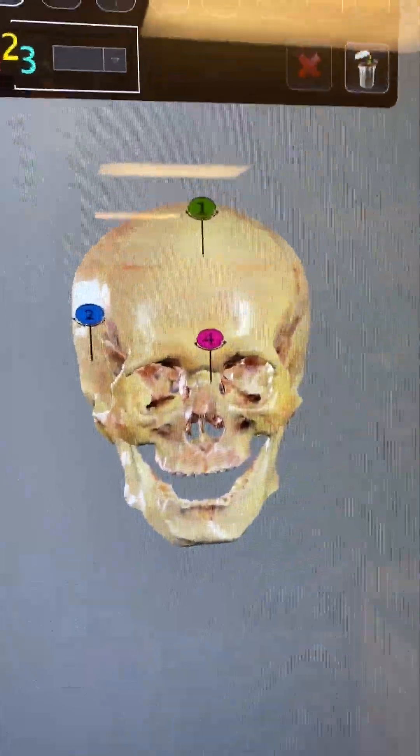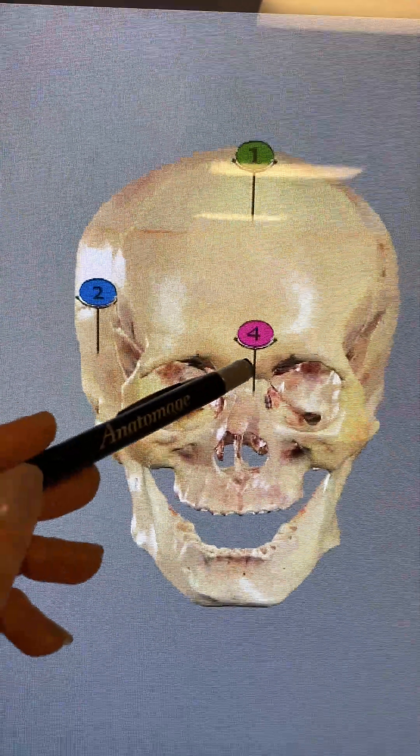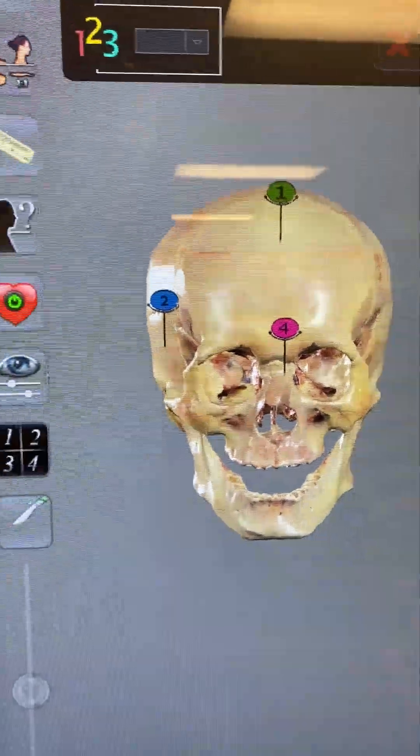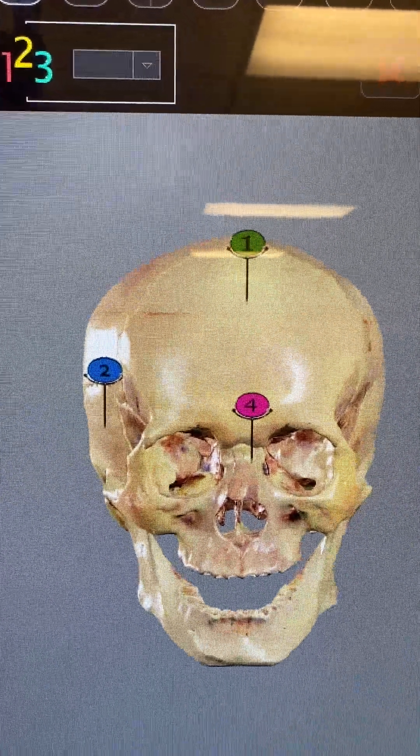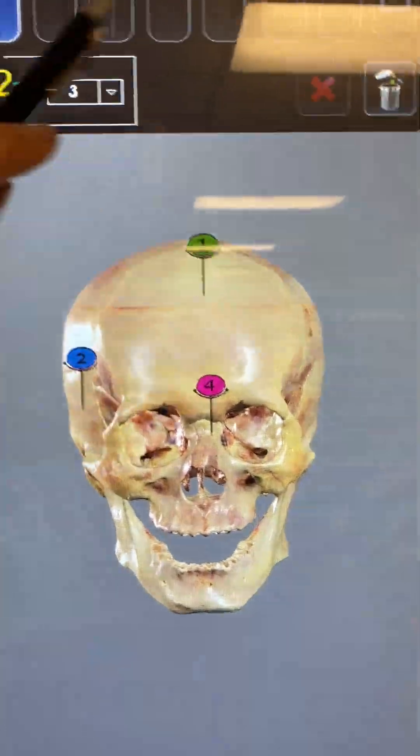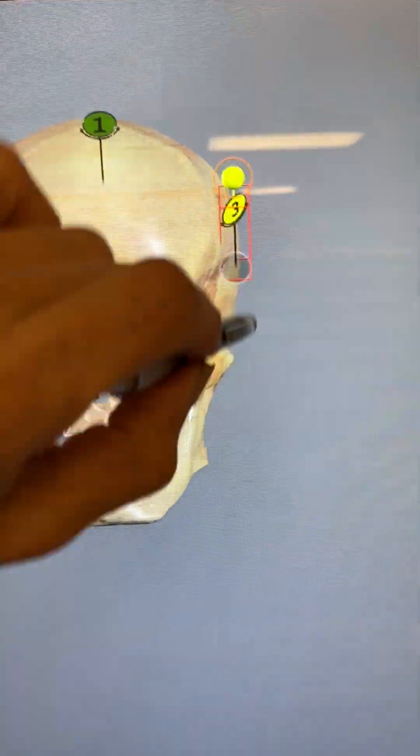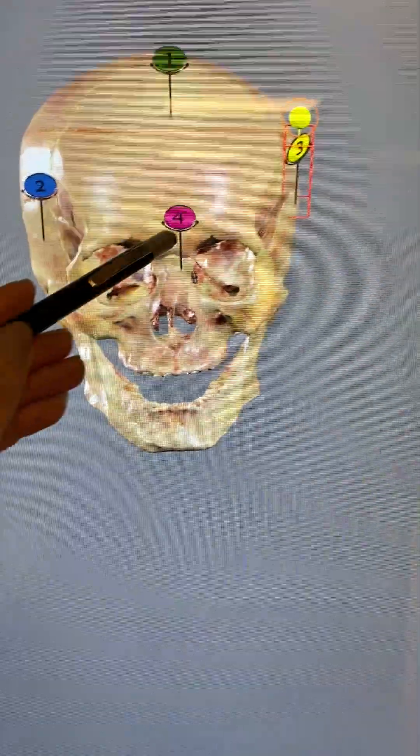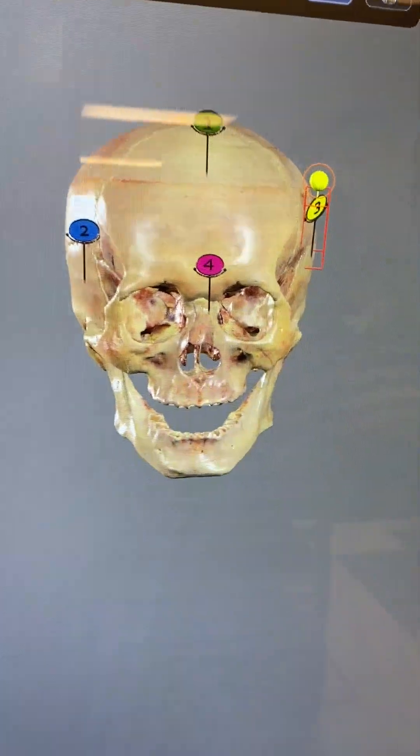The one I removed is number three, so it has one, two, and four. Automatically, if you add the next pin—again, I'm highlighting here to add the next pin—you see this jumps to number three. It comes to the next number. It wouldn't be number five; it would be the number you already removed.